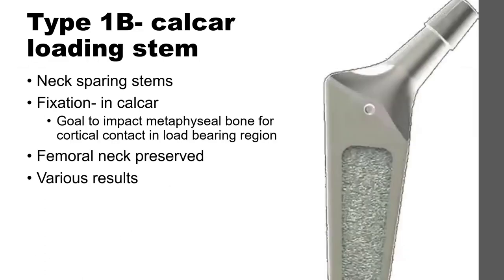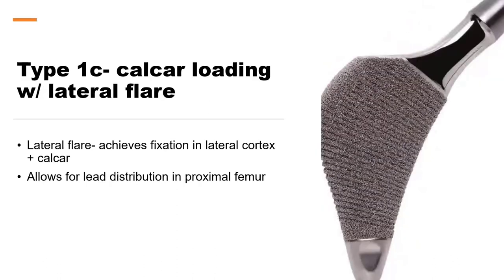And then the other one, my favorite, are we allowed to say brand names? I don't know if you have. Yeah, go for it. So there's the Depuy Proxima, which I call the chicken nugget because it looks just like a chicken nugget. I think that's the picture you have on there. Yeah, it looks like the chicken nugget. This one? Yeah, that's the chicken nugget, right? Doesn't it kind of look like a chicken nugget? I was actually talking to Dr. Chen. I was like, why didn't you put the chicken nugget in there as a subclassification? She was not amused.